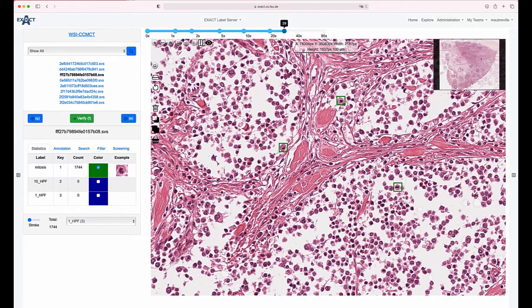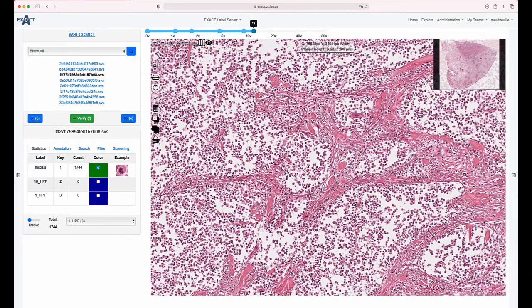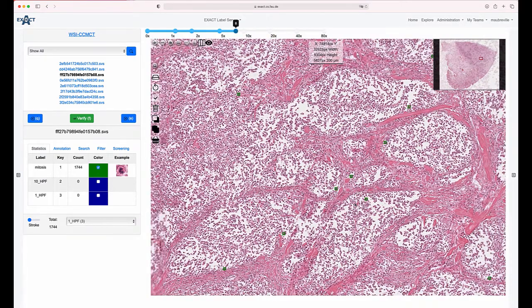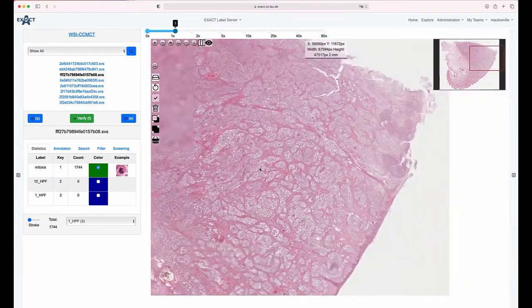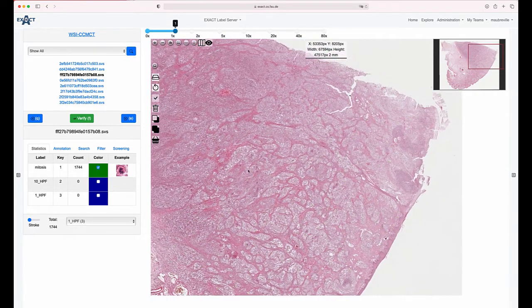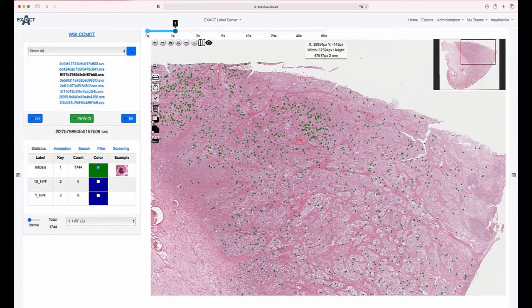Now if we zoom out of this image, you can hopefully agree with me that at the moment it's not possible to distinguish mitotic figures from other cells anymore. Okay, let's leave those annotations on, and zoom out and zoom out. Now, maybe the region where there's the most mitotic figures would have been rather here. But that's impossible to tell without those annotations.